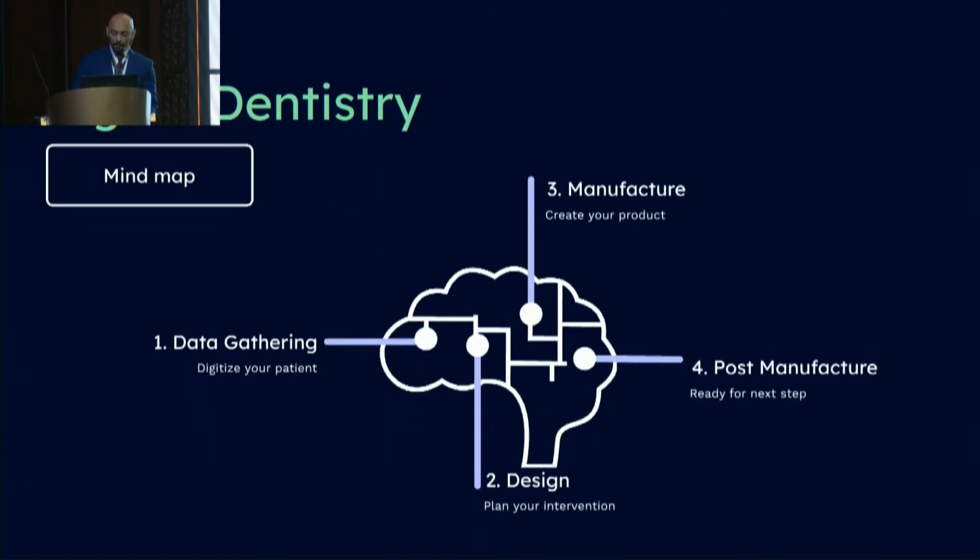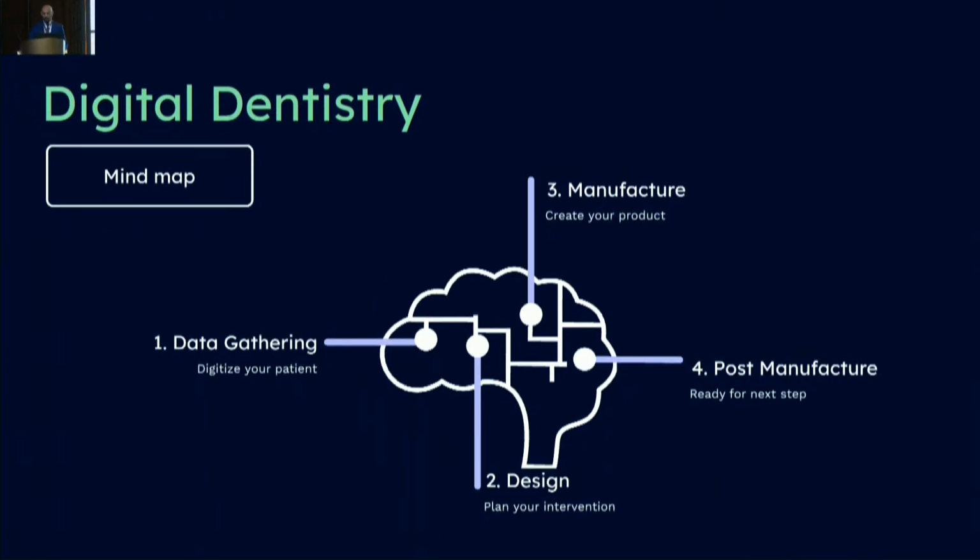By the way, I'd like to stress the fact that as a dentist, you're only responsible for good data gathering. The rest is the lab technician's job. This makes getting into the digital field actually easy. I can assure you that with our current technologies, you are able to fabricate literally any treatment modality in almost any restorative material with digital tech. You just need to find the lab for it.